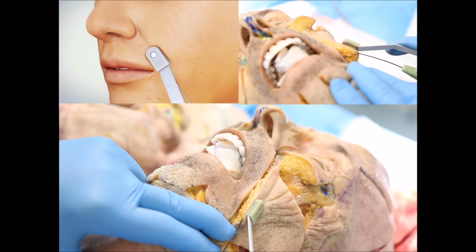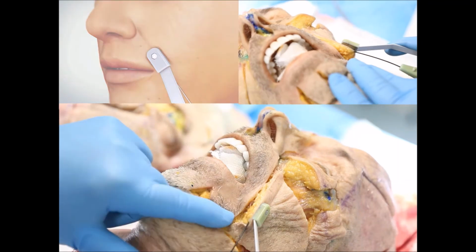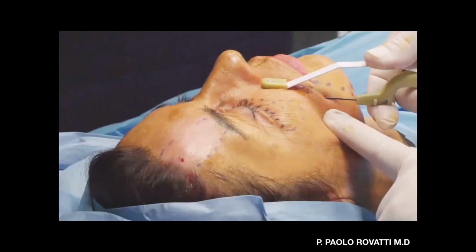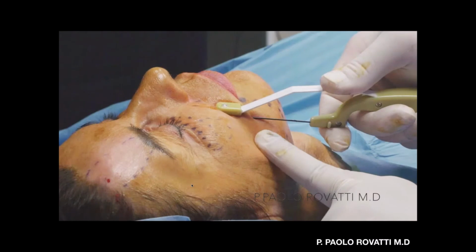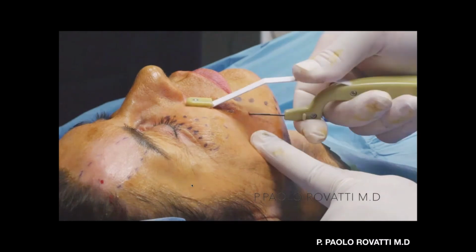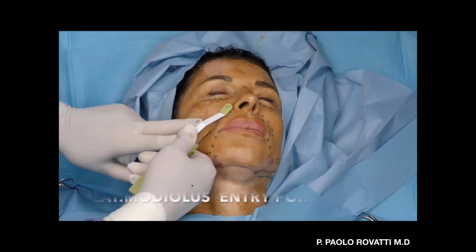Sometimes the nasolabial fold must be treated in this way before filling, because I think this is the best way to reduce the fat that is sagging down, stopping just where the ligament starts. And sometimes if you start to fill first, you can have worse results. So that is a good treatment above the line that I've shown, and I'm treating, look, stopping and stopping.